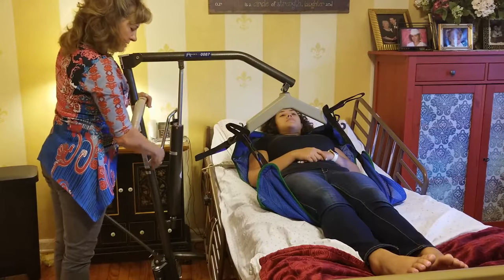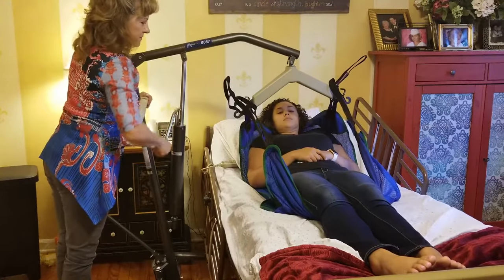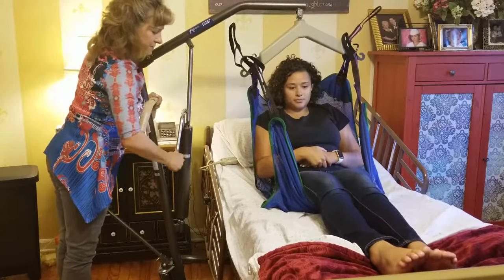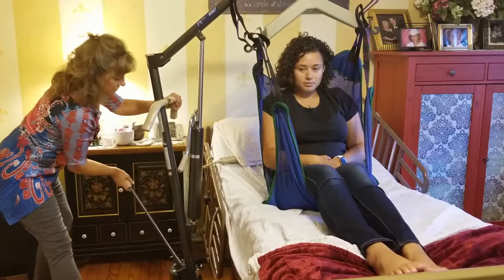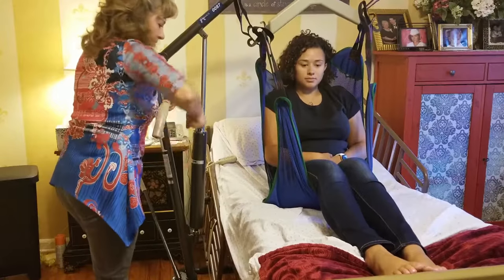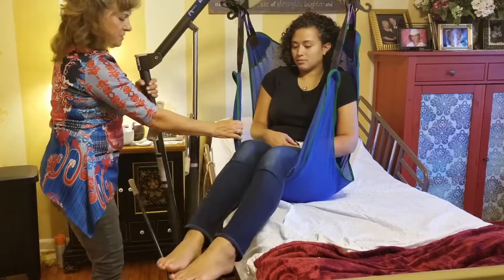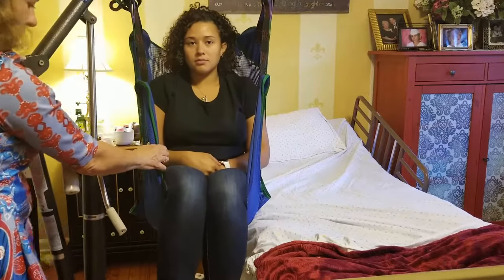Turn the black knob toward you and gently crank the patient up. Watch that all body parts are inside the sling and that they're nice and secure. Keep cranking and you can see the patient comes off the bed. You may need to open the base crank a little more for stability. Once she's off the bed, guide the sling with you and let the person know you're moving them from the bed to the wheelchair.